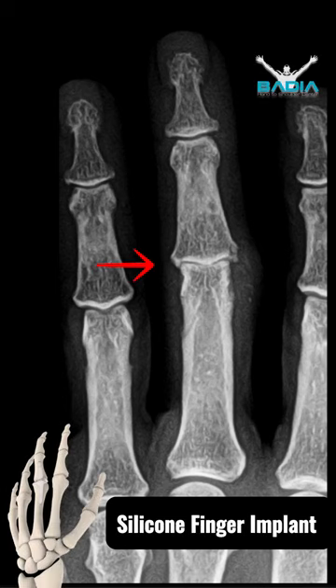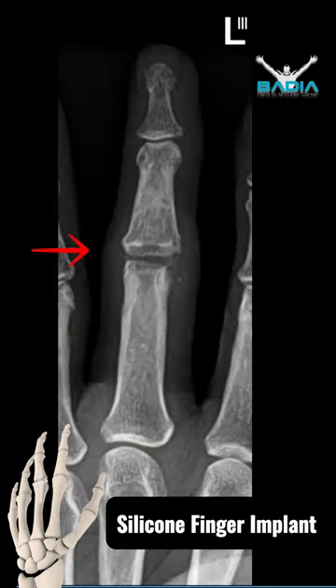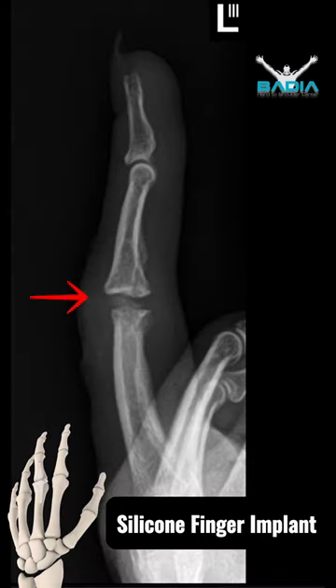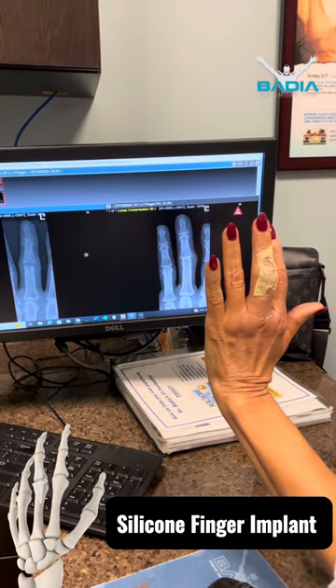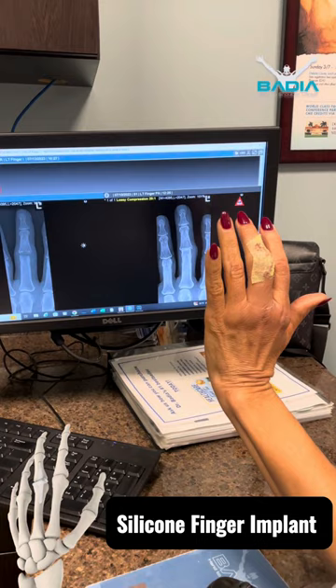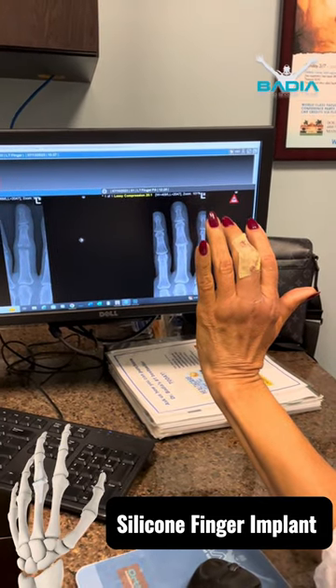Take a look at these before and after X-rays. The patient had no joint space before, and now after the silicone implant you can see the joint space. This is a PIP — proximal interphalangeal — joint replacement for an arthritic, painful joint. In specific scenarios, this is a good indication for somebody who wants pain relief but wants to maintain motion.